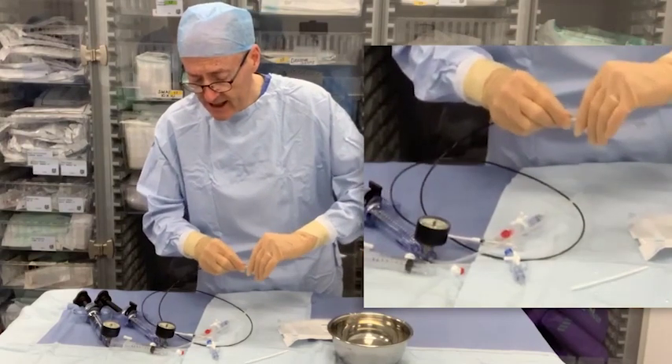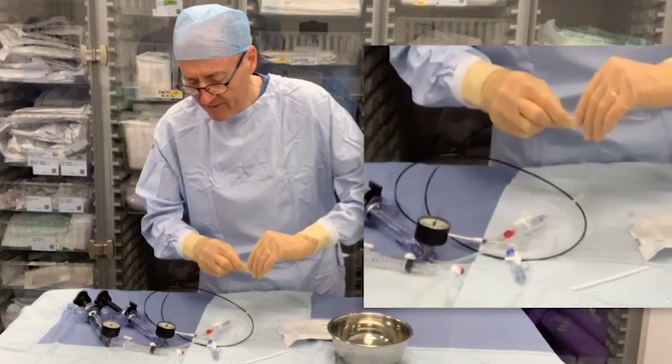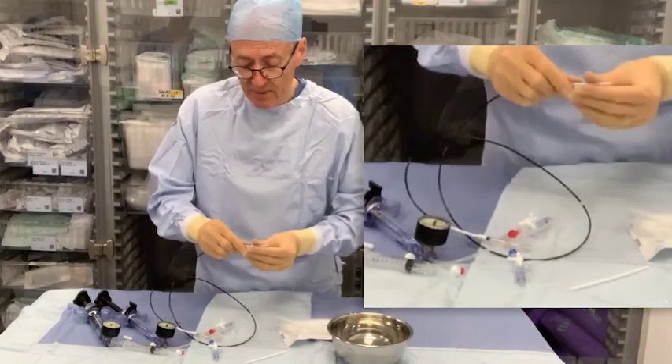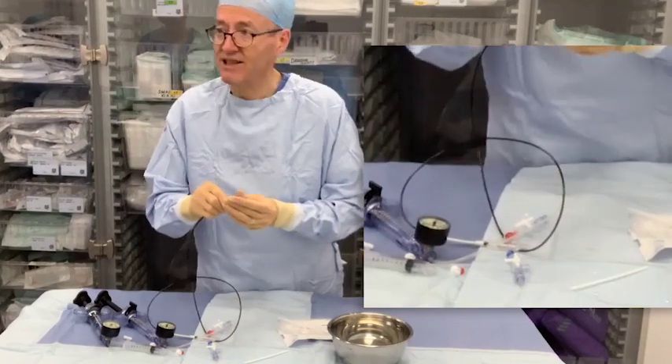This balloon is actually a Gemini — 14 millimeter diameter, 50 millimeter long outer balloon — and the inner balloon is a centimeter less, which would make it 40 millimeters if that's correct.